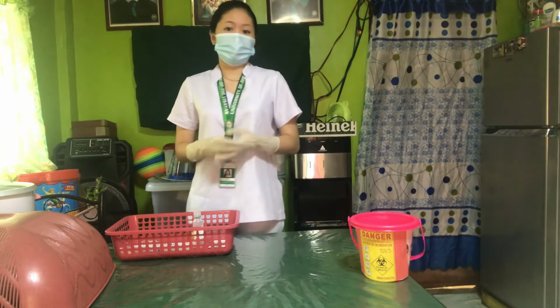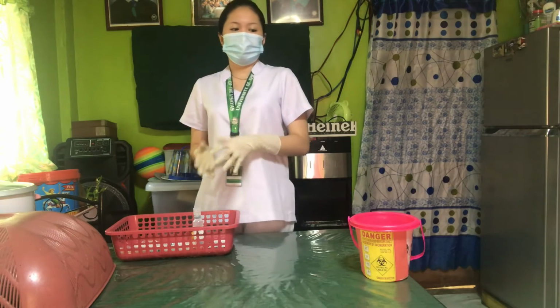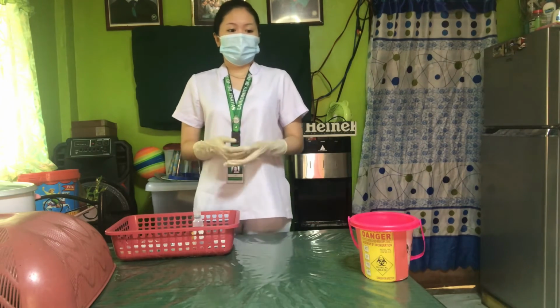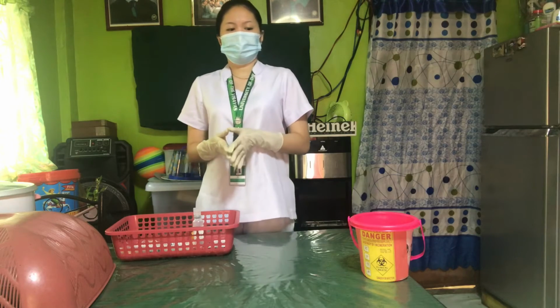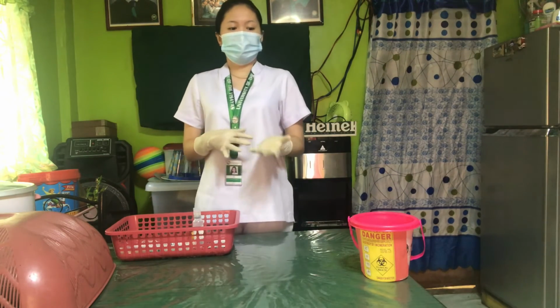Let's proceed to the next step, which is mix the solution by rotating the vial between the palms of the hands. Mixing ensures an adequate concentration and thus accurate dose. Some vials contain aqueous suspensions which settle when they stand.